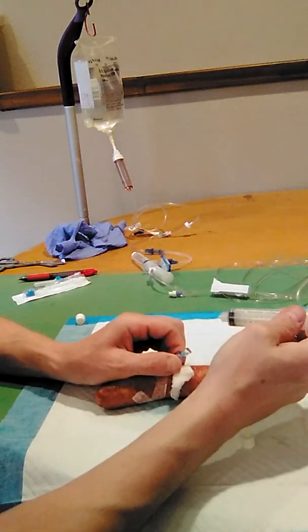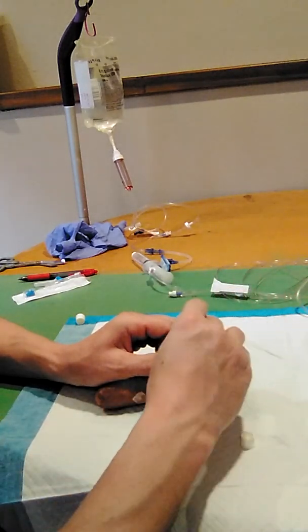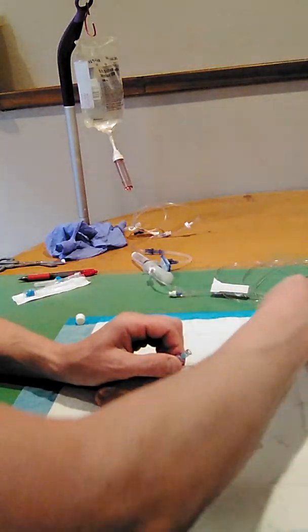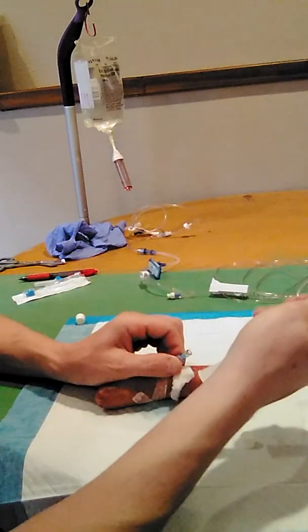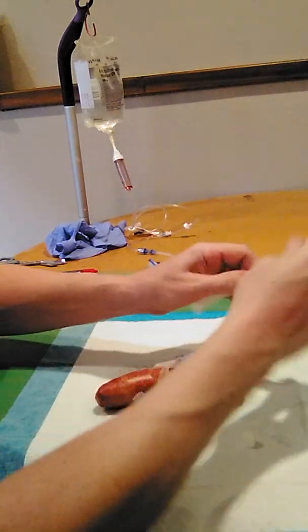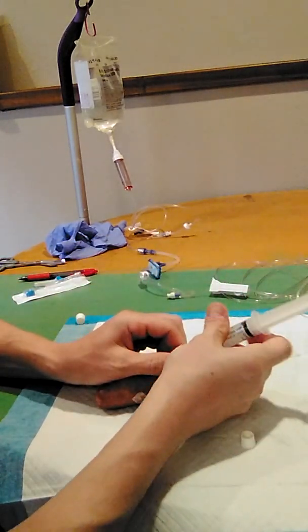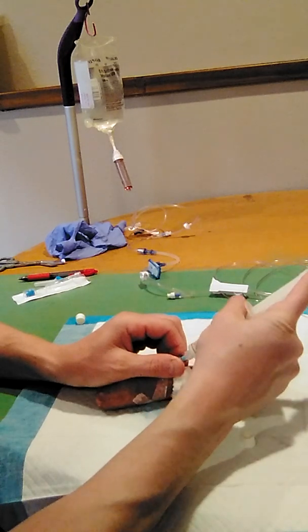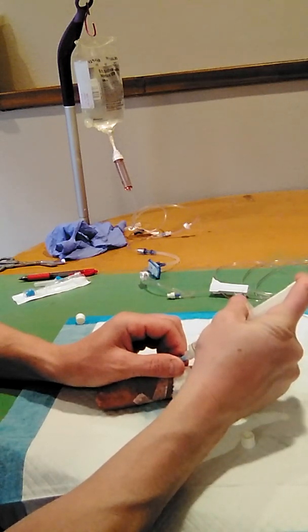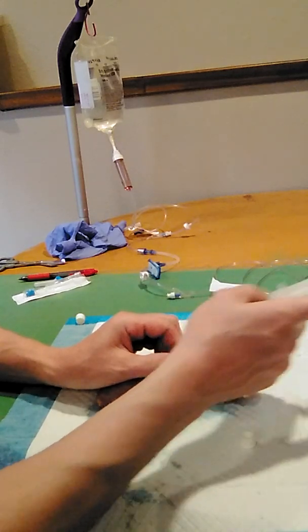So this is the medication that is now administered. So I'm going to clean my hub again and obtain a new 5 milliliter flush solution in a syringe. I see that 5 milliliters is flushed now.